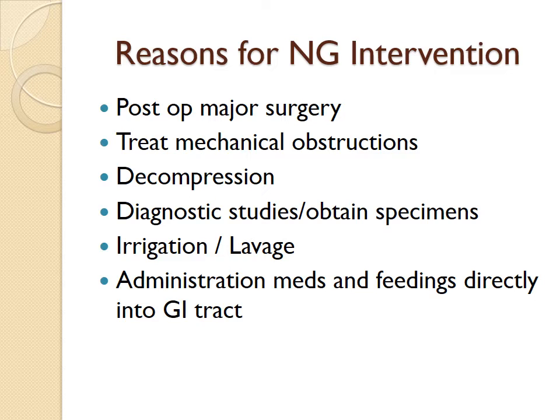Okay, with decompression, for some reason something's blocked and it won't pass downward through the GI canal. It can be fluids and/or gas, so we just want to decompress and allow it to relax itself and then come back up into work.